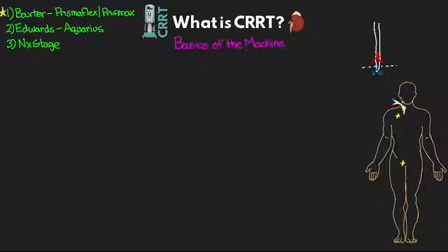All right, so now that we have the talk about access out of the way, the first part of the machine that I actually want to talk about is going to be the blood pump.